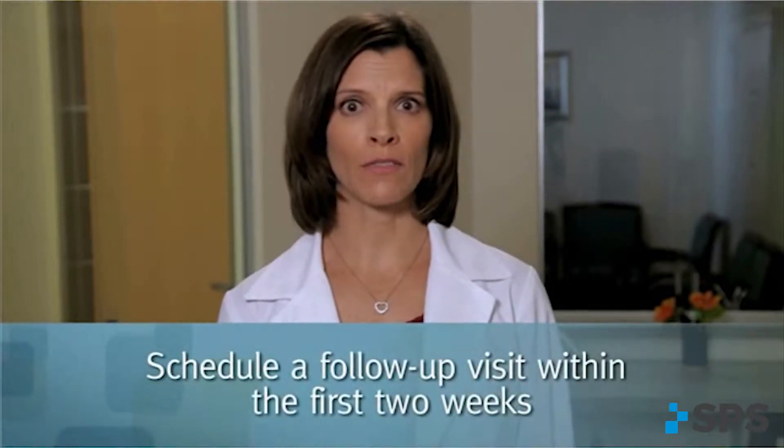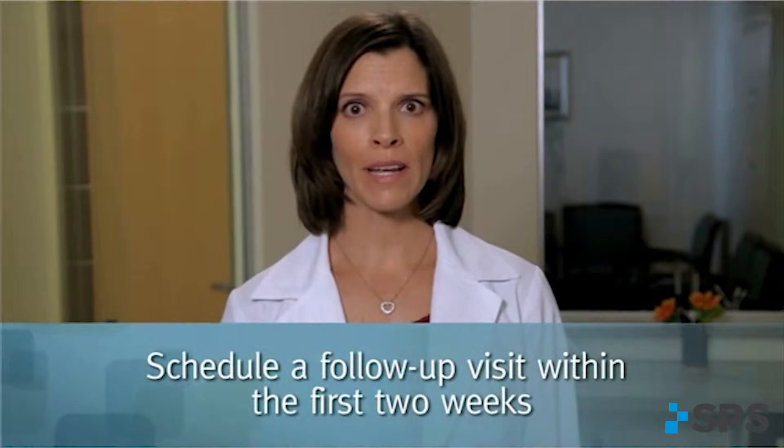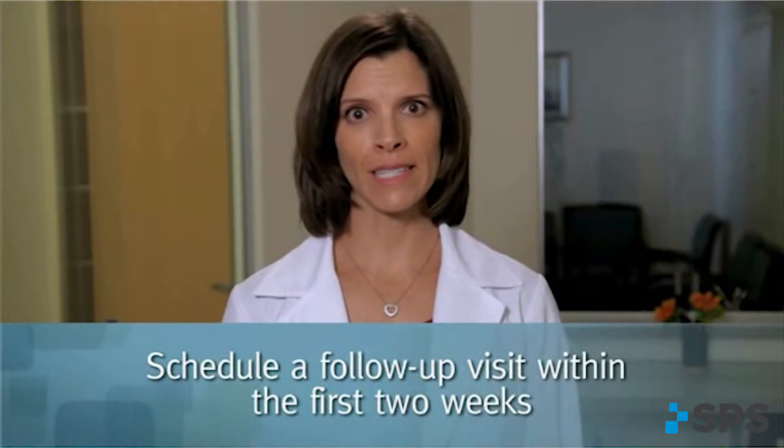The patient's commitment to using their new WalkAid system and your ongoing support are essential to the patient's success. At the delivery appointment, schedule a follow-up visit within the first two weeks, and schedule regular follow-up visits for a preset duration. Future visits can be scheduled as needed and will vary from patient to patient.